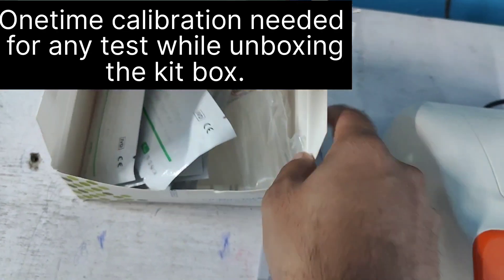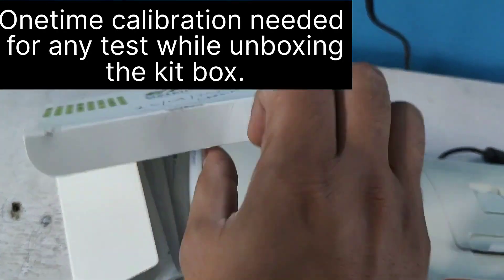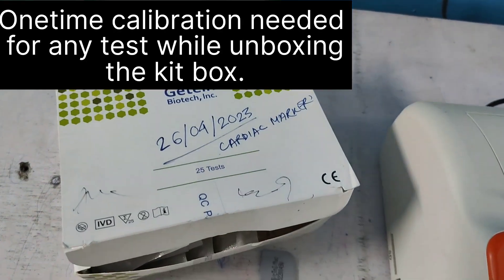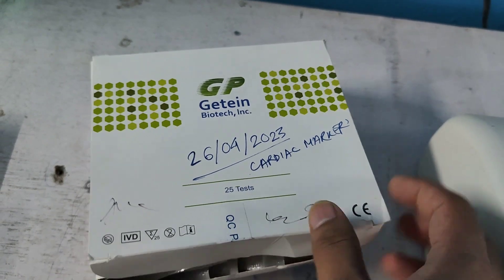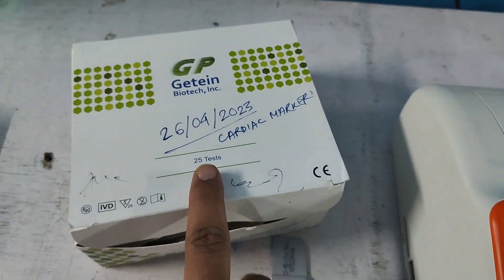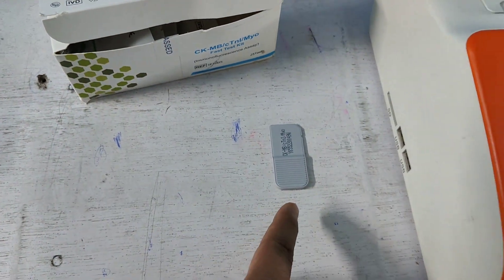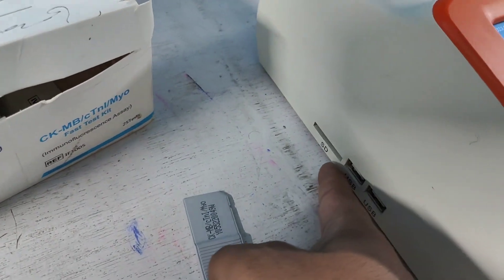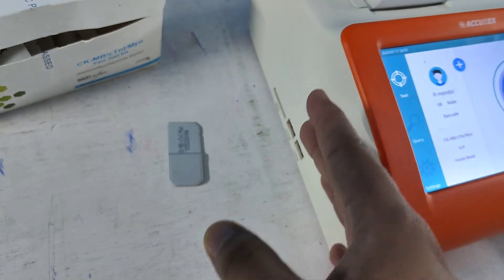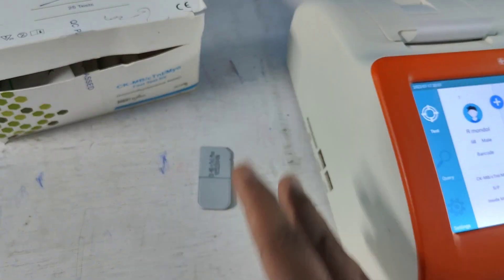This box usually contains 25 kits. For those 25 kits, when you open the box for the first time, you have to perform the calibration by inserting this chip into the SD card portion — and the machine gets automatically calibrated. After that, you can perform the tests without inserting the chip again.